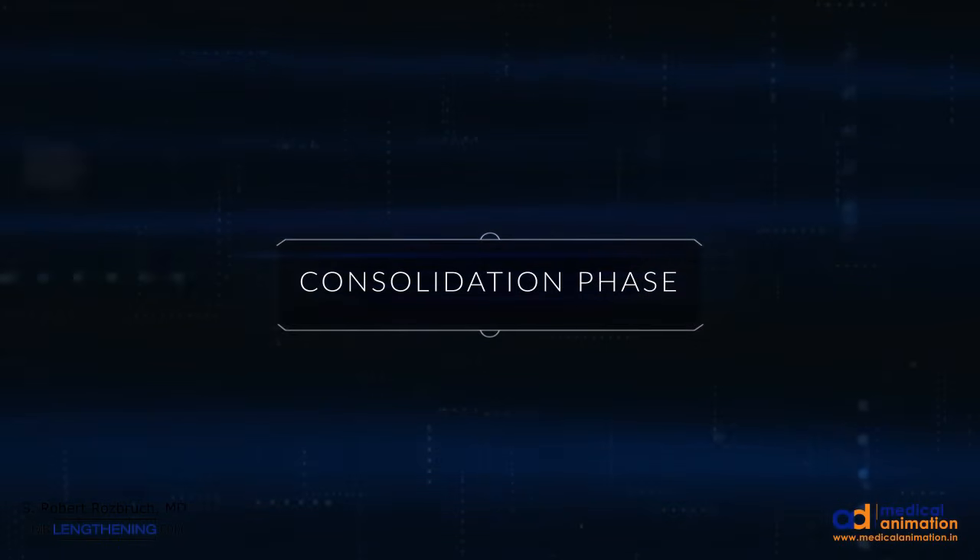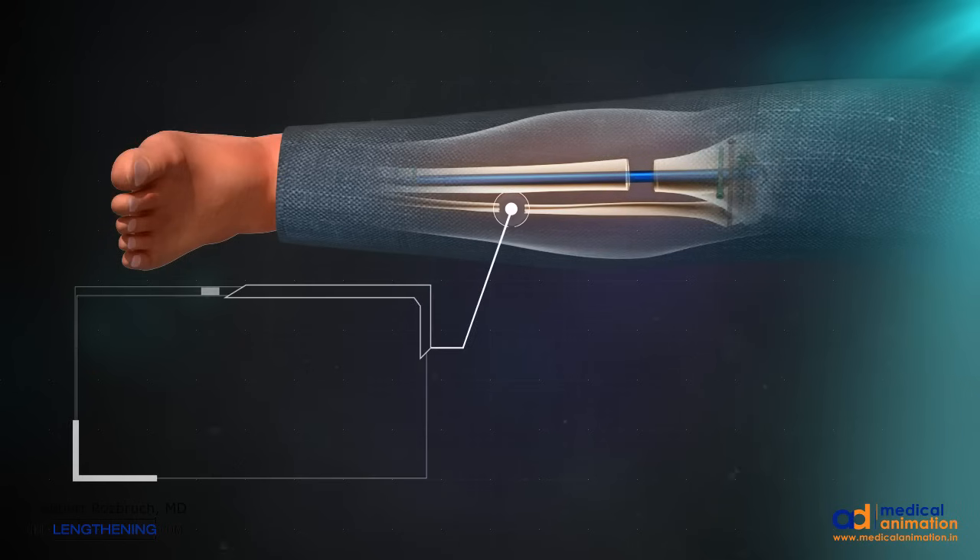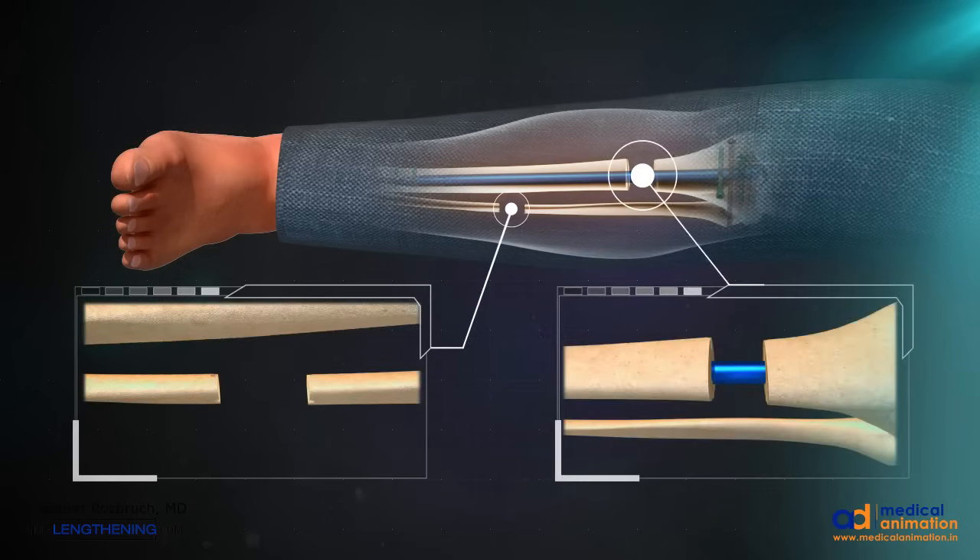Once the full length has been obtained, consolidation begins — that is the mineralization and hardening of the regenerate. This shows a gradual consolidation and calcification of both the fibula and the tibia lengthening sites.